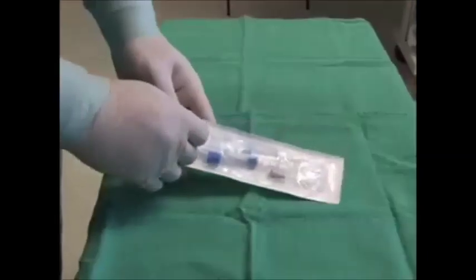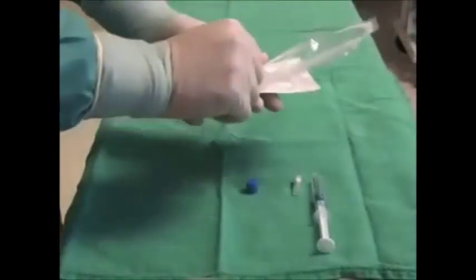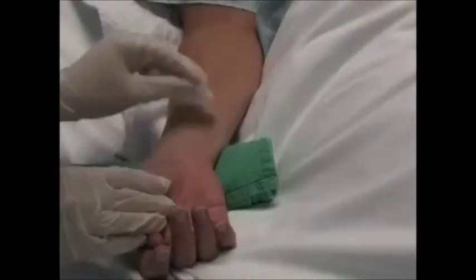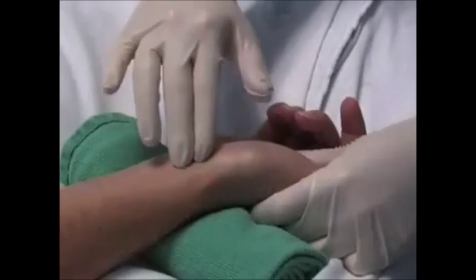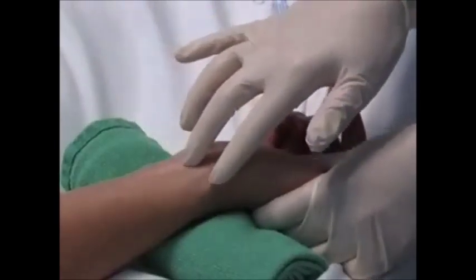Open the arterial blood gas kit and identify all the components so they are ready for use. Clean the site with an alcohol swab. Palpate the radial pulse and determine the point of maximum impulse, or use the Doppler ultrasound device to identify the location of the radial artery.